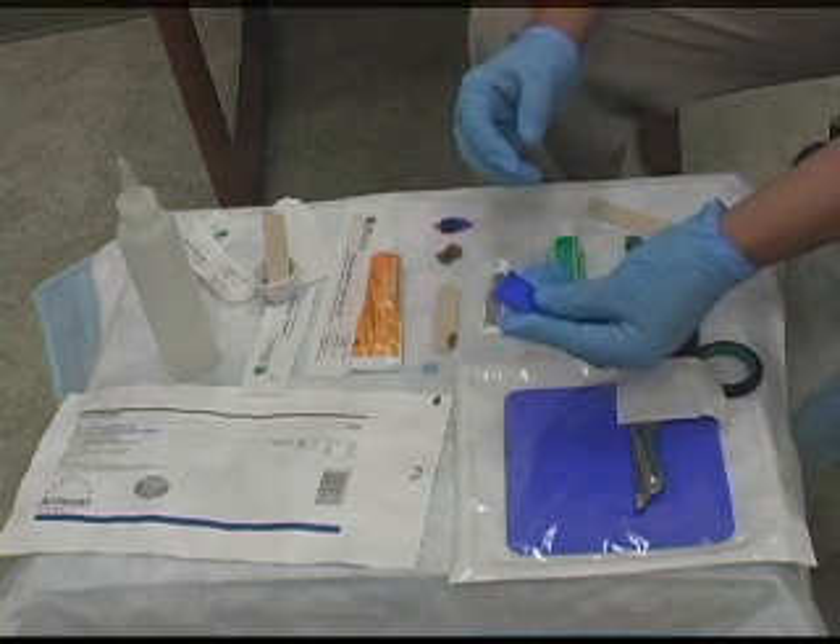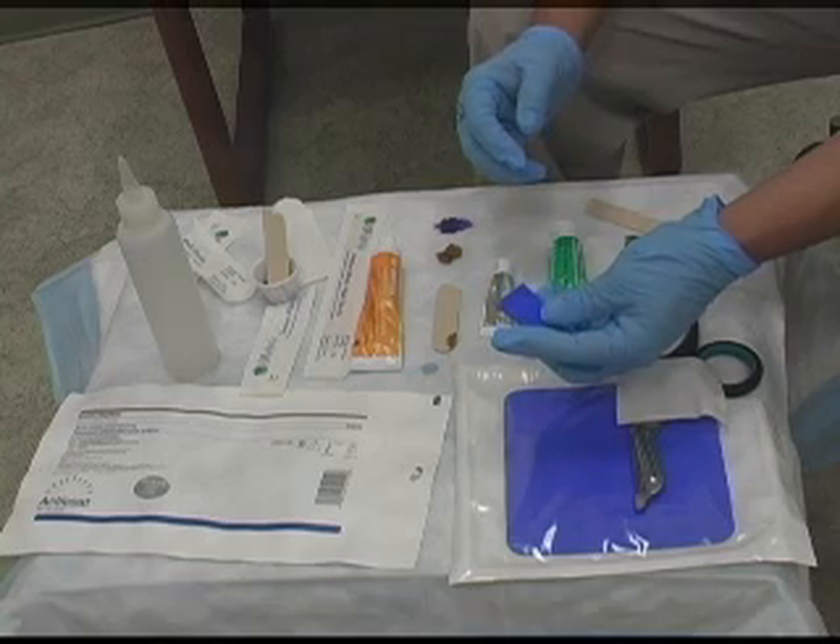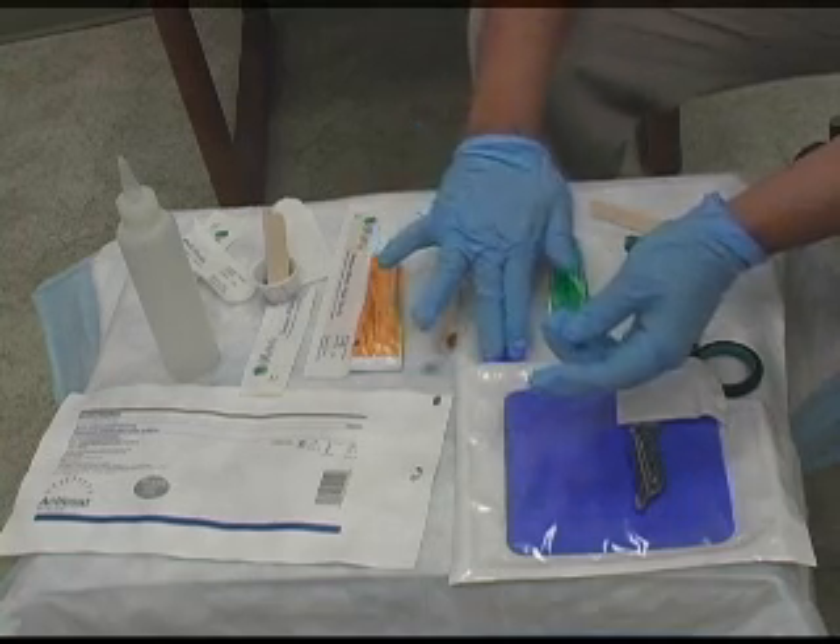This will be a Monday, Wednesday, Friday dressing change. You can leave it on there — I believe it's made for a three- to five-day dressing change. This works really well.